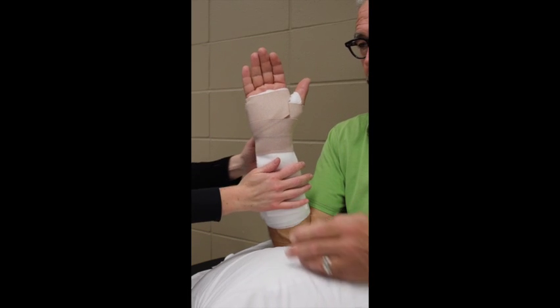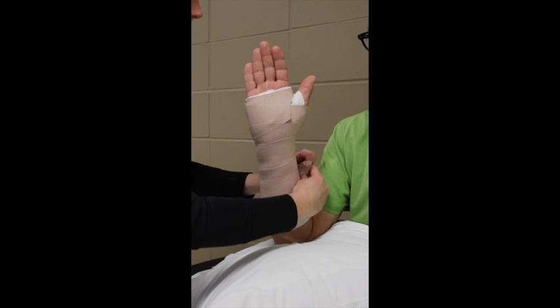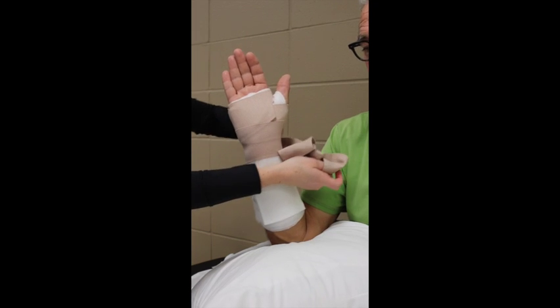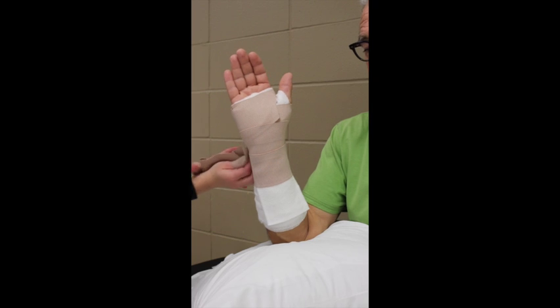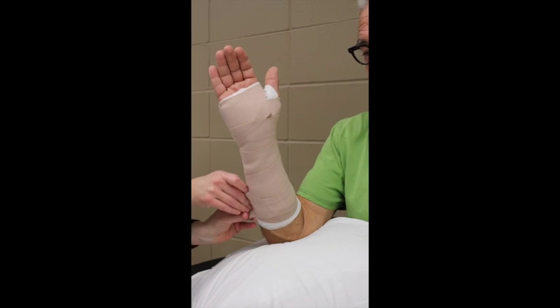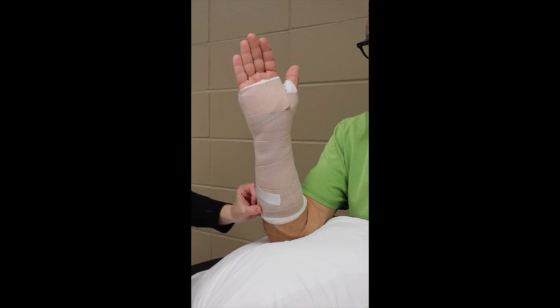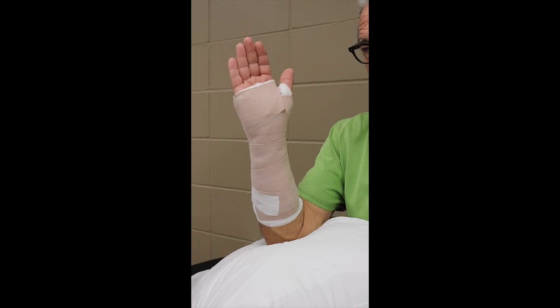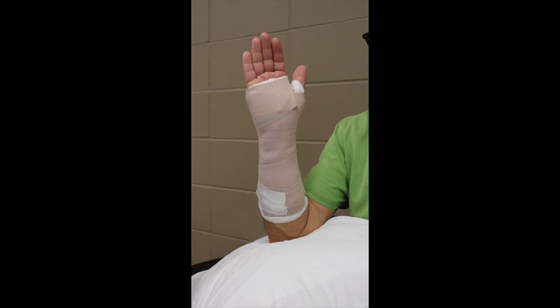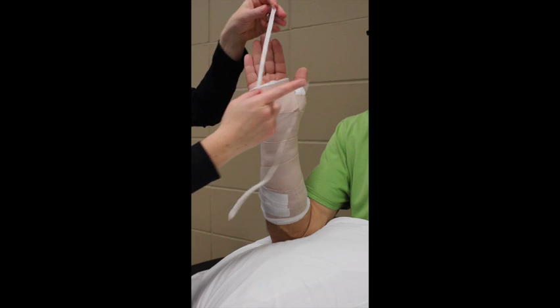I'm not pulling too hard — again about 50% tension, overlapping by 50% as I wrap the rest of the splint. We try to use just one ace bandage, so if you don't make it all the way back up, spread out your wraps so that we just use one elastic bandage for a short arm splint. Use tape to secure the end. Then I create smaller pieces of tape to go through the web space and around the hand to hold all the edges and corners in place, and it keeps the patient from messing with it — most of the time.